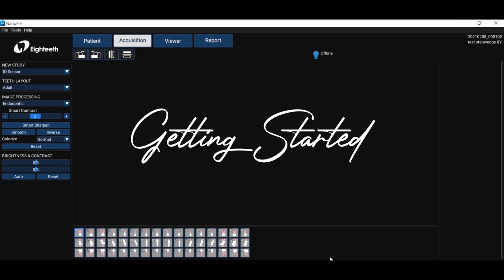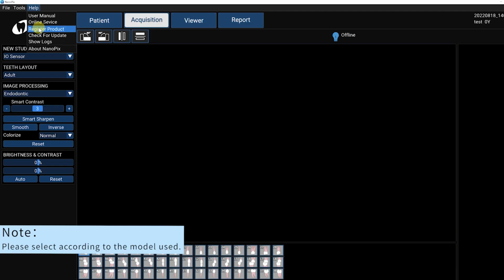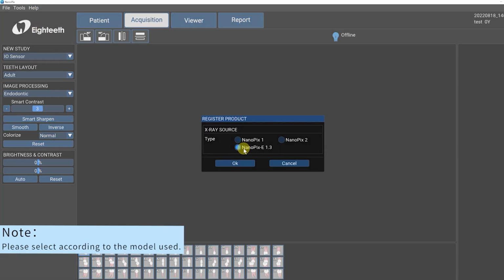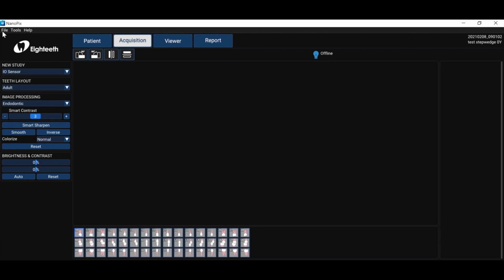Okay, so here we are. We're into the software. You made it. It's such a great, simple, effective software to use. So let's just go ahead. I want to walk you through a couple things.